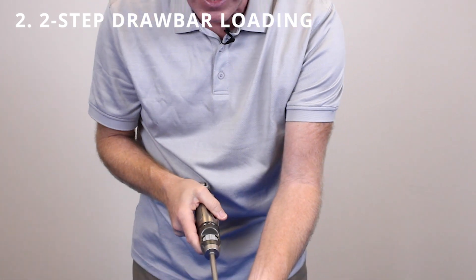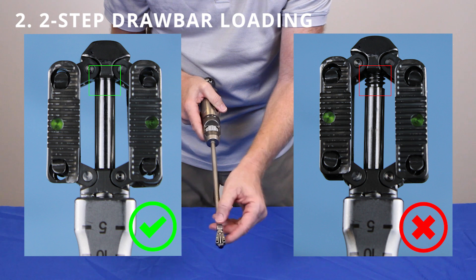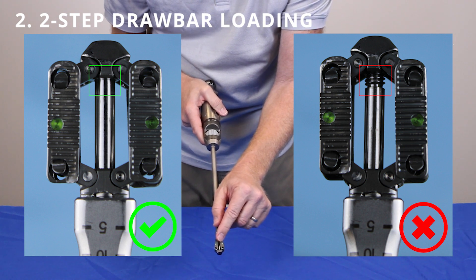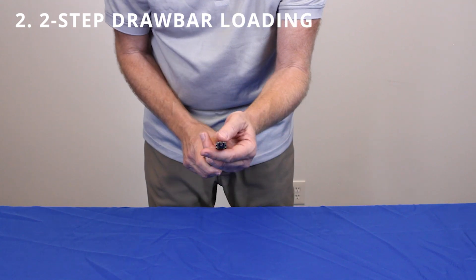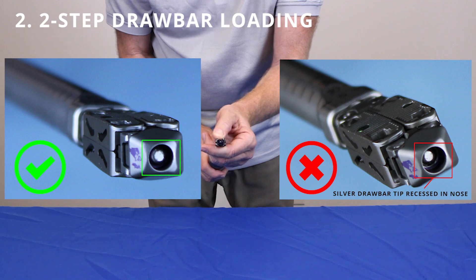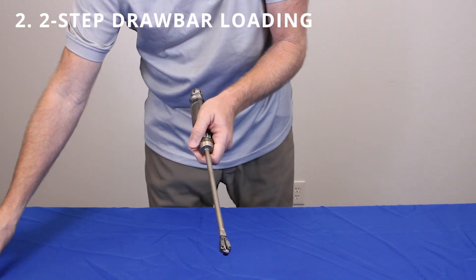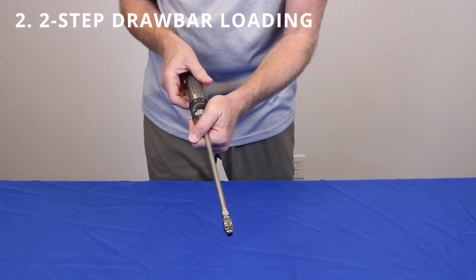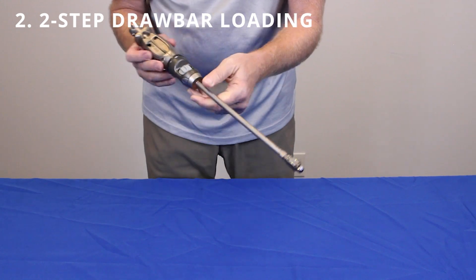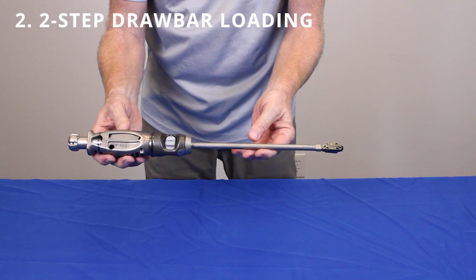You'll notice that the implant is slightly splayed. Look through the graft window to ensure that there are no visible threads of the drawbar seen through the implant. Secondarily, look at the distal tip and make sure that the drawbar is threaded all the way to the nose. Then pull the pin and turn the handle counterclockwise — that collapses the implant down to the appropriate starting position in order to hand the implant to the surgeon for implantation.